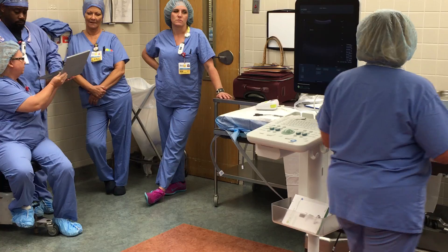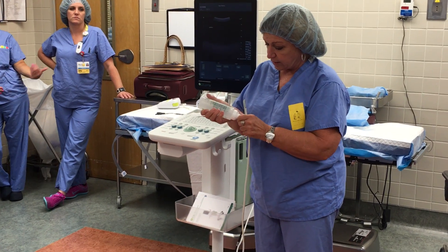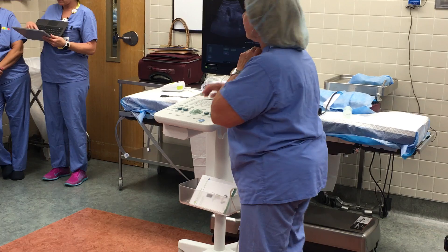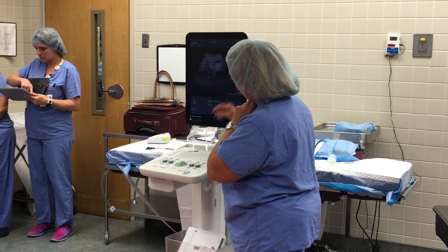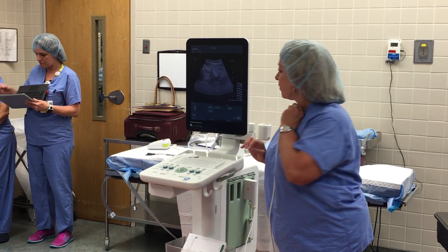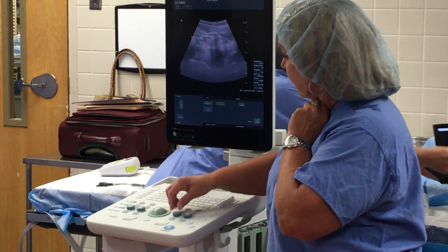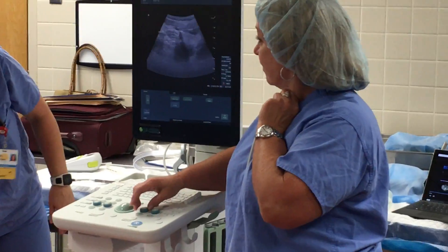This is the most sensitive part of the transducer. I'm going to put some gel on it. Every time you look at the ultrasound, always have them turn down the lights so they can see better — they always forget to do that. One of the buttons you're going to be using is called Gain. It only amplifies the signal; it makes the image darker or lighter. You just turn it like that.